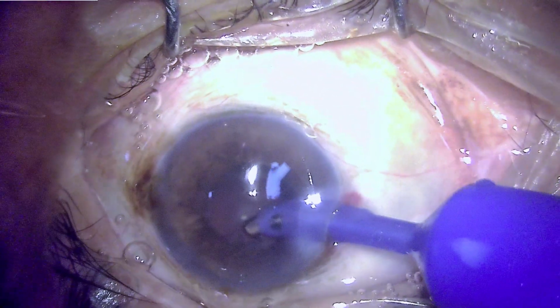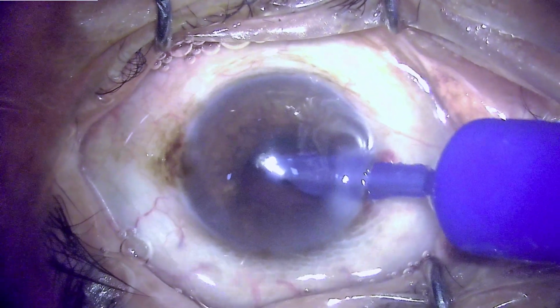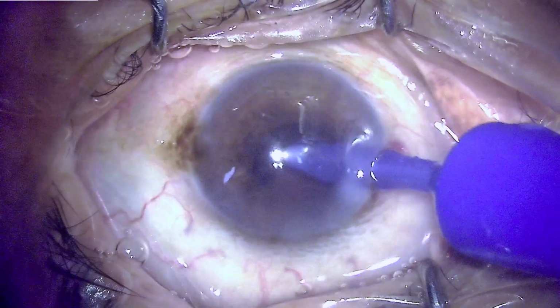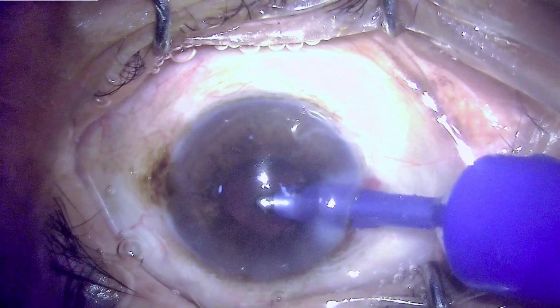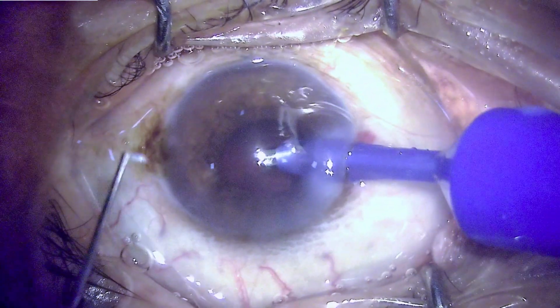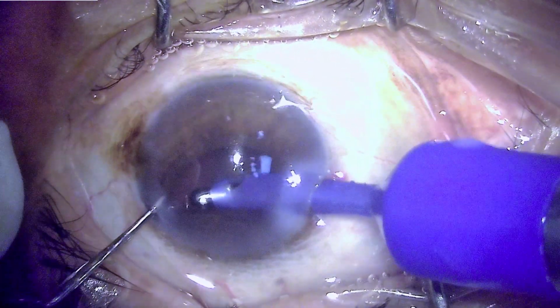However, if the epinucleus is seen in the center, it is easier to aspirate, but here we can see the anterior end of the lens matter fibers are all hidden behind the iris surface. So one has to go behind the iris a little deep, try to engage the epinucleus, which is now shaped like a bowl, and then aspirate it and pull it to the center.